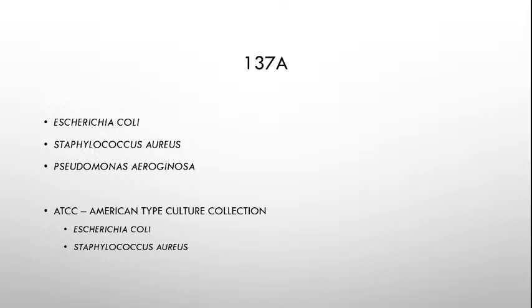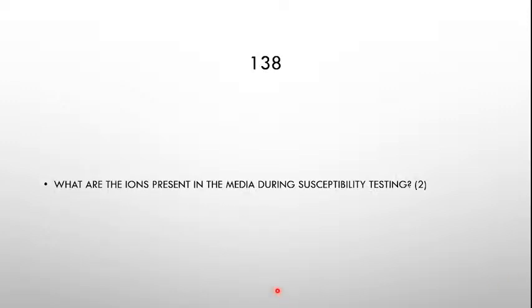Okay? So, yan yung ATCC type. Alright, so now there are ions present that need to be measured or determined when you are doing quality control for your susceptibility media.